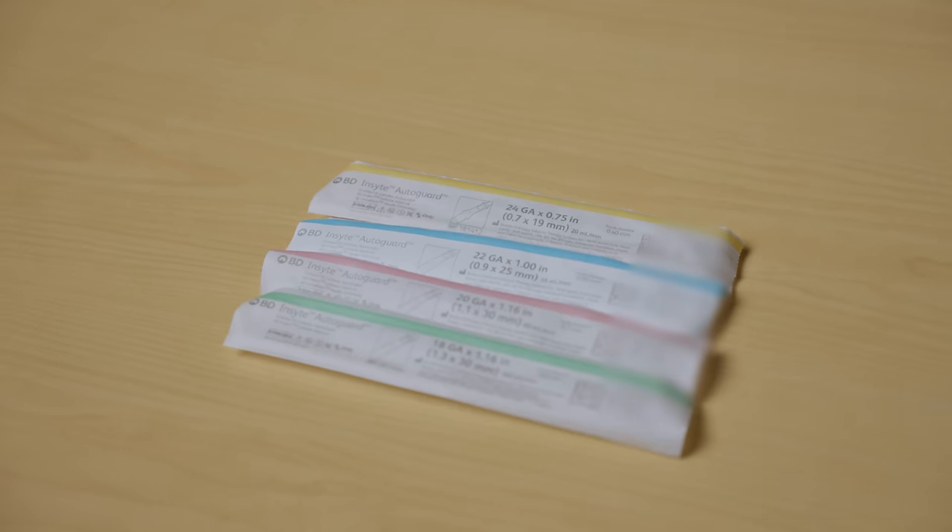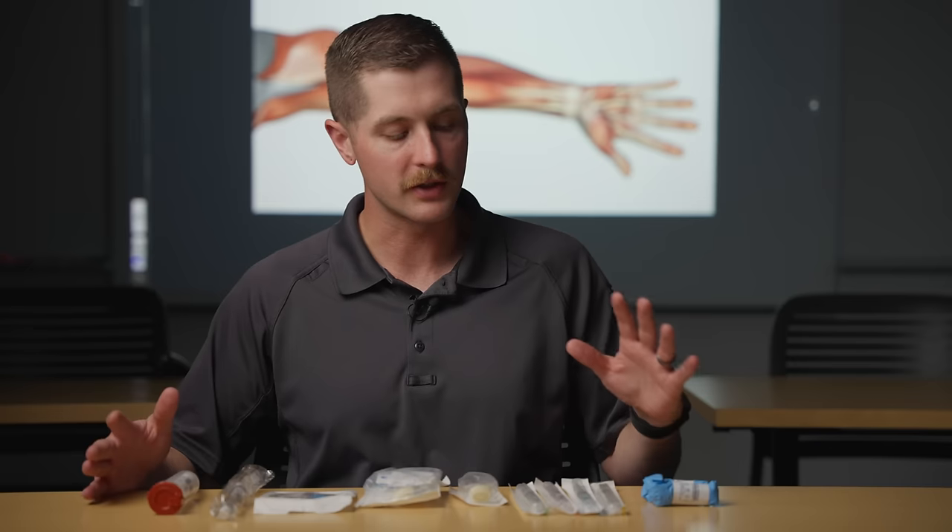In front of you I have all the supplies you might need to start an IV. Now there are some minor differences in brands depending on what your employer buys or what you buy, but the procedure remains largely the same.